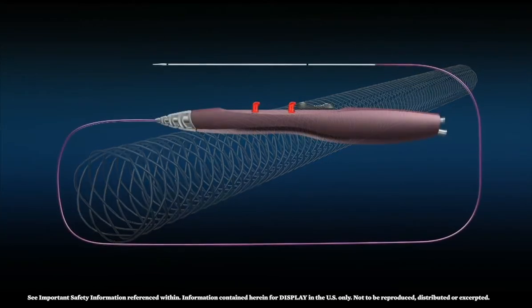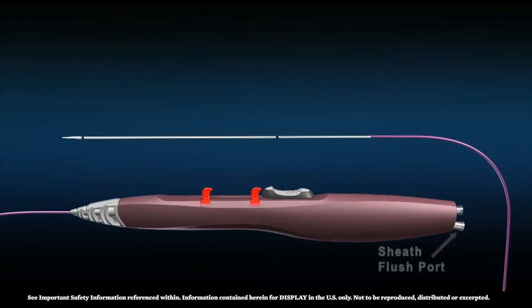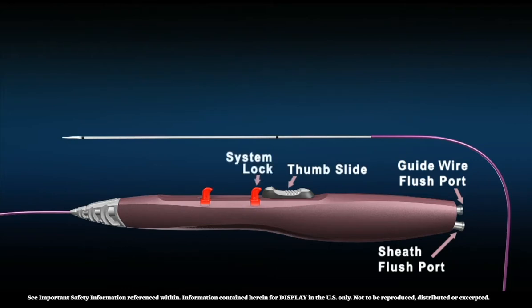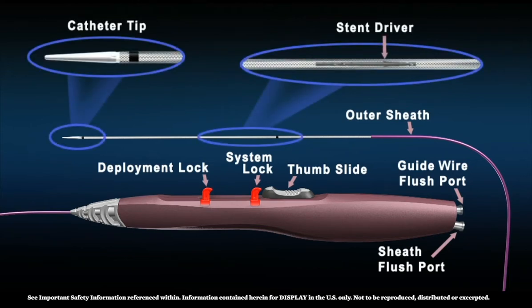Before we begin, let's review a few key aspects of the delivery system: sheath flush port, guide wire flush port, thumb slide, system lock, deployment lock, outer sheath, stent driver, catheter tip, and stent.